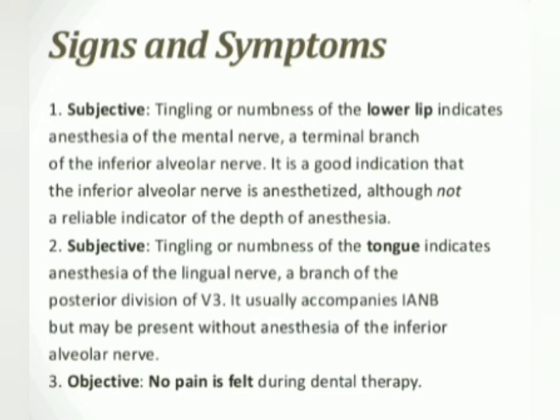Subjective: tingling or numbness of tongue indicates anesthesia of lingual nerve, a branch of posterior division of mandibular nerve. Objective: no pain is felt during entire dental therapy.